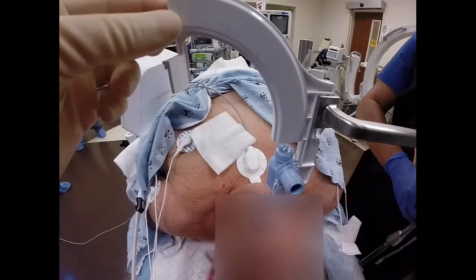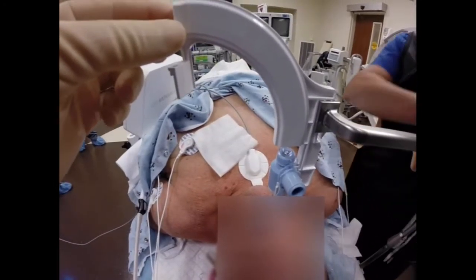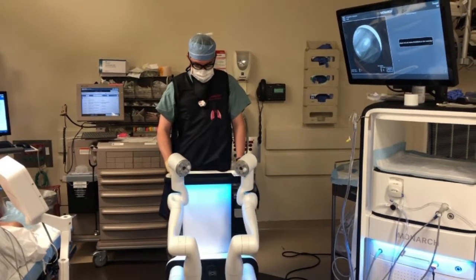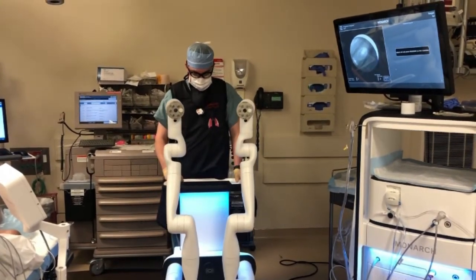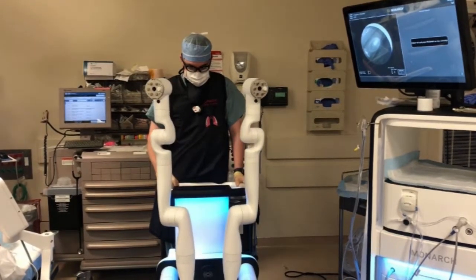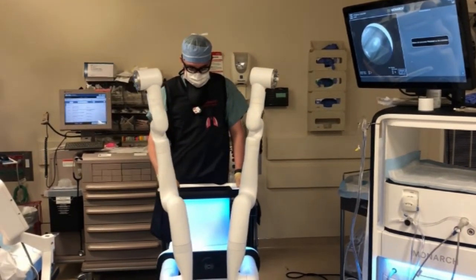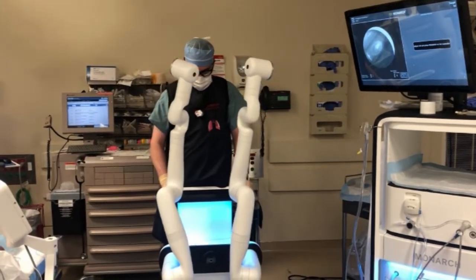The procedure was performed in the operating room under general anesthesia. After intubation, the endotracheal tube is fixed in position with a tube holder. The robotic console is a movable platform with two robotic arms that have 18 degrees of movement to allow precise navigation to the target lesion within the lung.